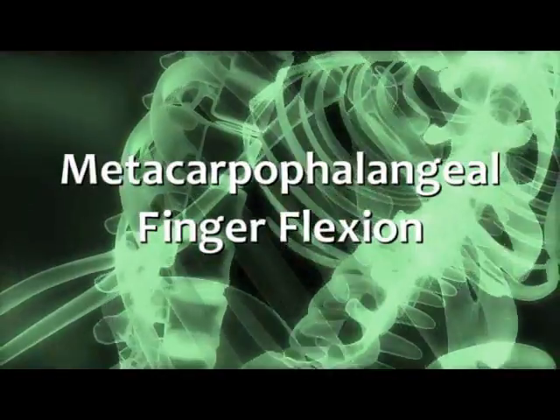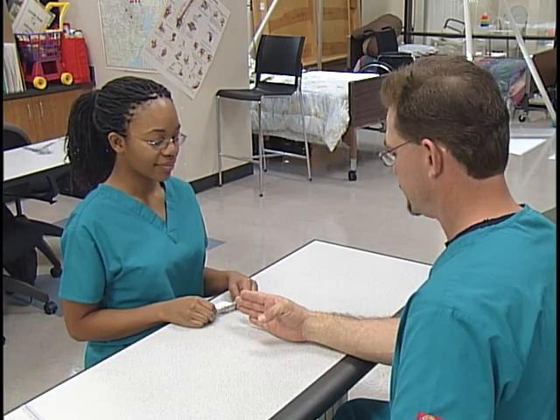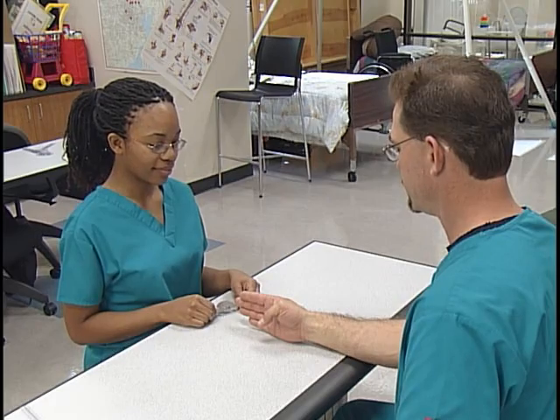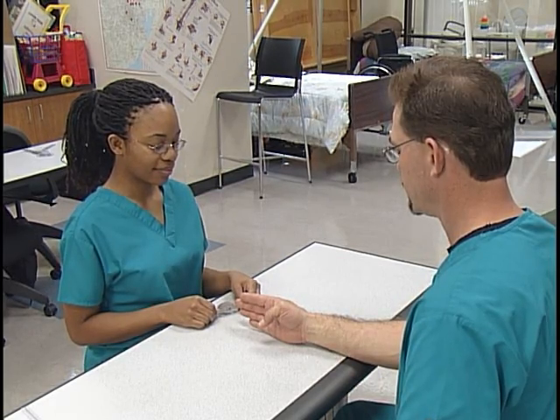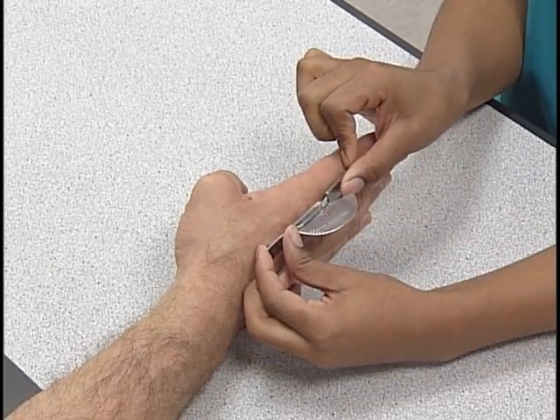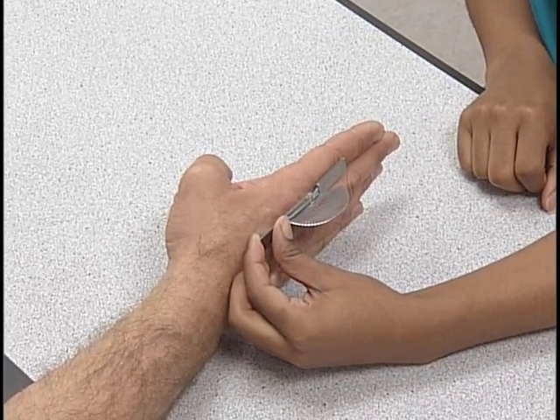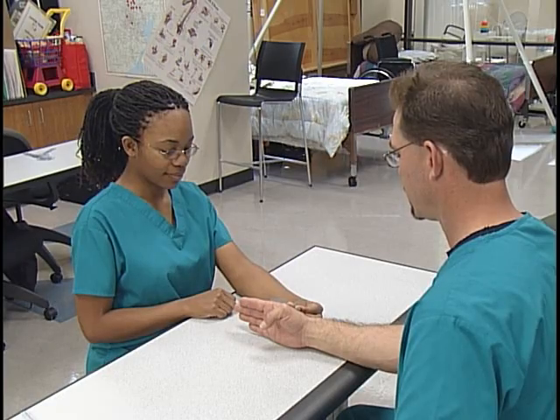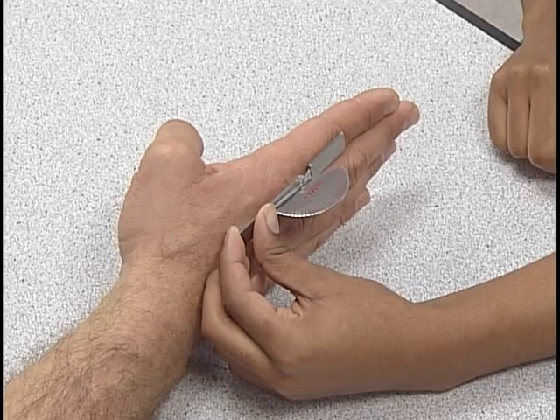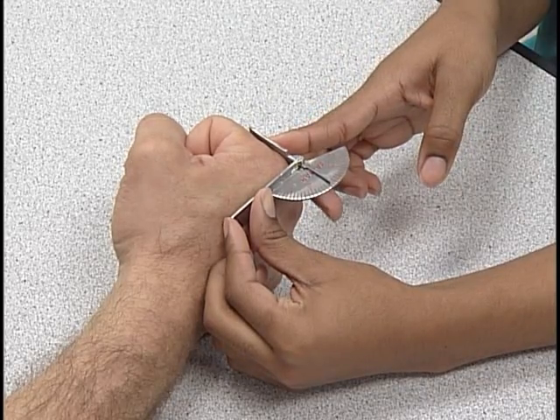For finger metacarpophalangeal flexion, the subject is seated with the forearm in mid position, wrist in zero degrees neutral, and forearm and hand supported on a firm surface on the ulnar border. The axis of the goniometer is centered on top of the MP joint of the index finger. The stationary bar is on top of the metacarpal and the movable bar is on top of the proximal phalanx. The client's finger distal of the MP joint is flexed down in a sagittal plane. The measurement begins at zero degrees and ranges to 90 degrees.